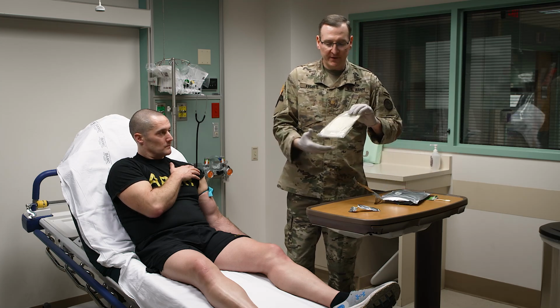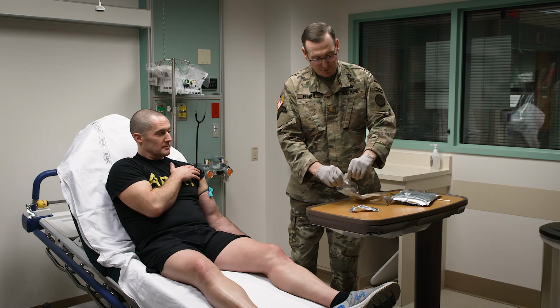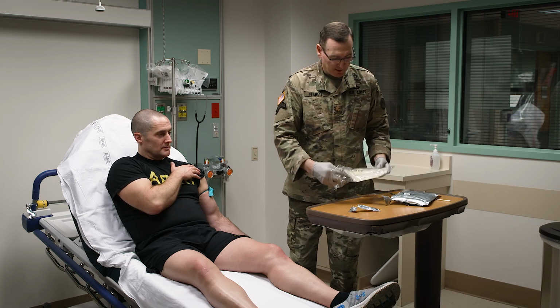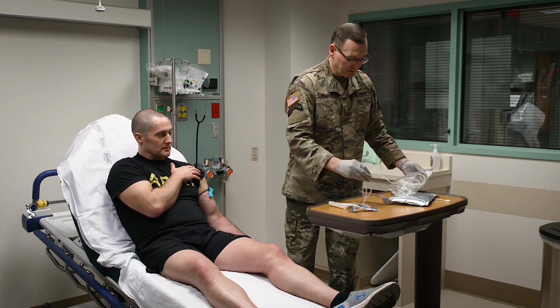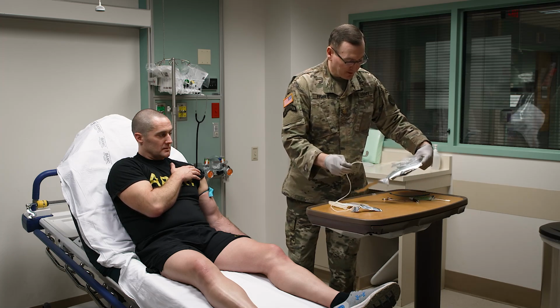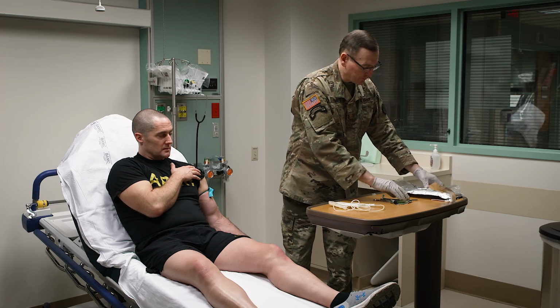And inside you'll find the blood collection bag in another clear wrapping. Just go ahead and take it out of that. And these are both disposable. You do not need to keep them. You can go ahead and throw them away with the rest of your trash that you have from treating your casualty.